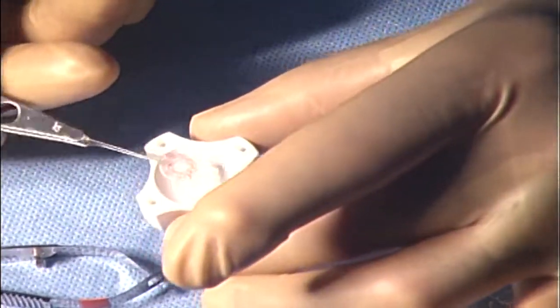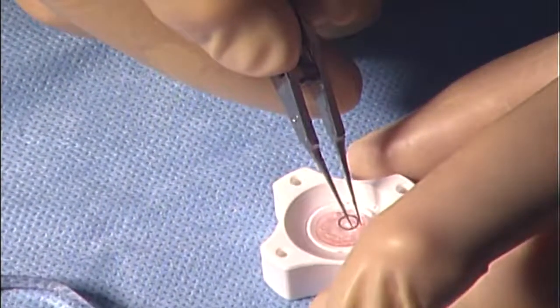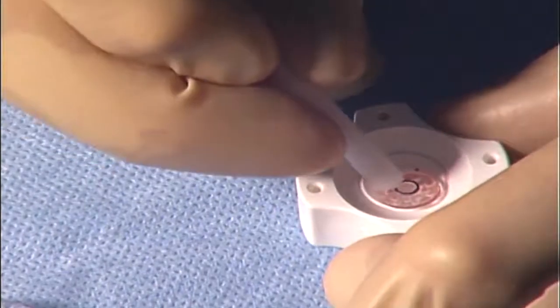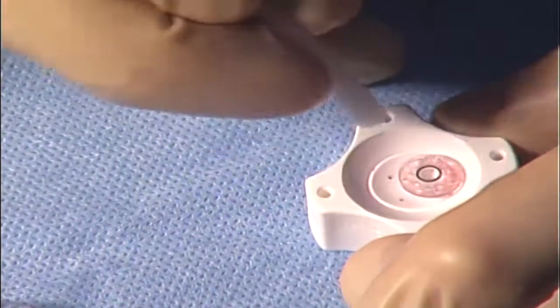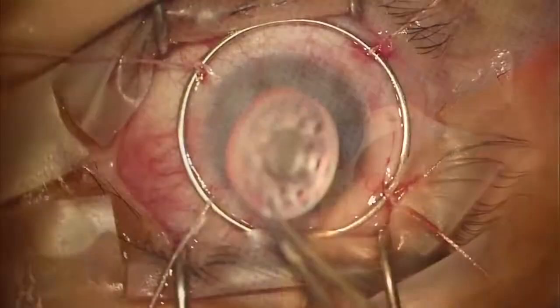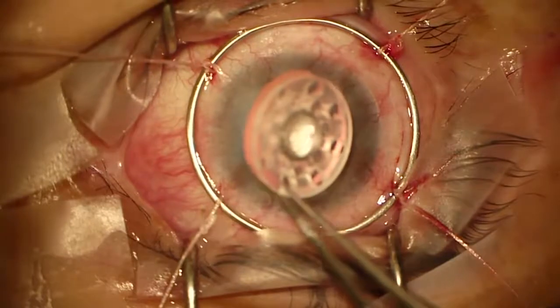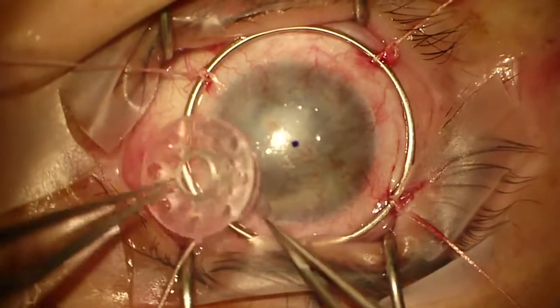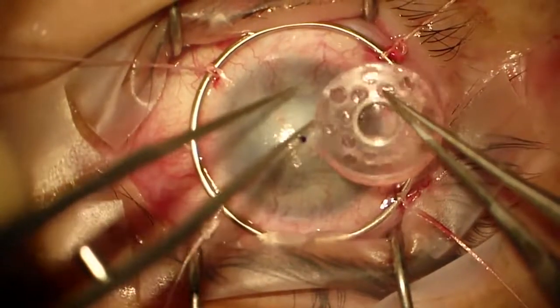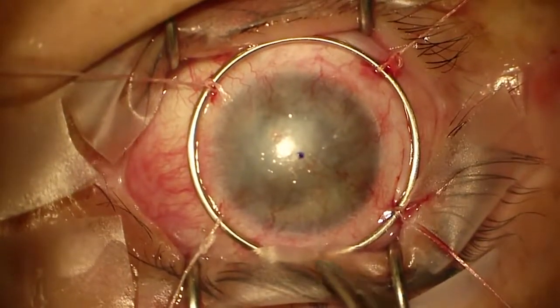We notice that it looks very nice from the front. I'll show it to you under the microscope in a moment. So here you can see the entire unit put together. The carrier cornea on the front, the central optical plate, and on the back is the locking ring to ensure that everything stays in position. So now we'll make a trephine opening and prepare to do the extracapsular cataract extraction.